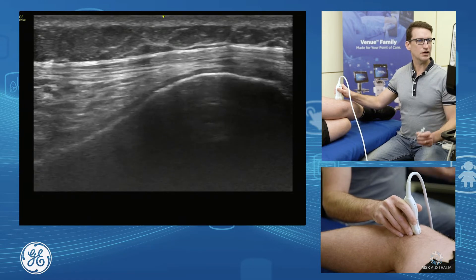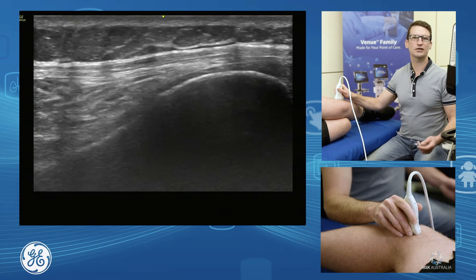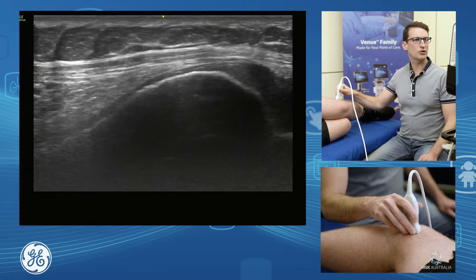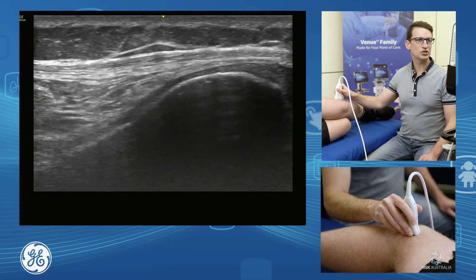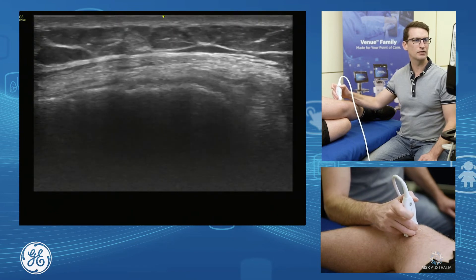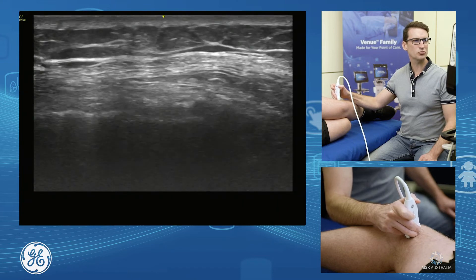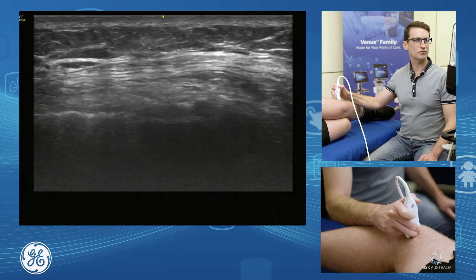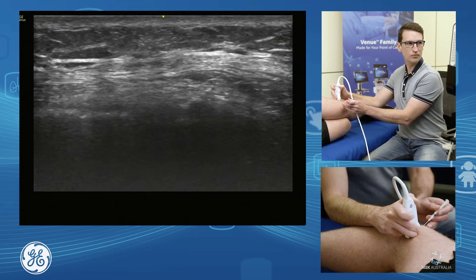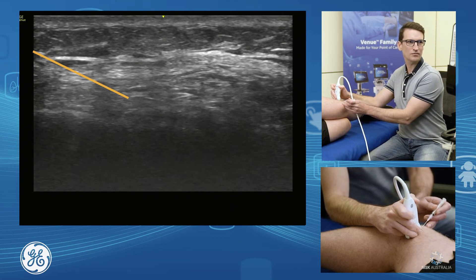This is excellent on MRI, but ultrasound is equally as good at showing this. This is our typical runner's issue — a runner with a little bit of pain just above the lateral femoral condyle is a bit of a giveaway. For injecting these, I like to go in the transverse plane. We've got our ITB sitting up over the bone just proximal. This is our little fat pad — we want to start our approach from just a centimetre off, guiding in and under the iliotibial band and injecting through that fat plane.